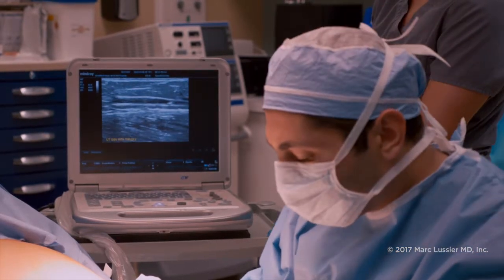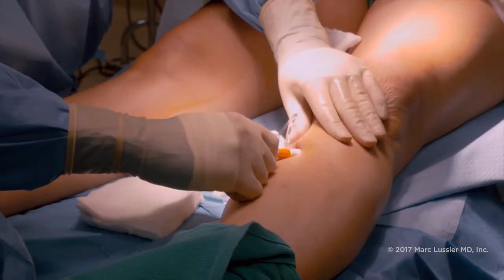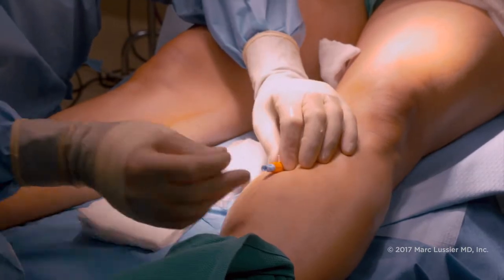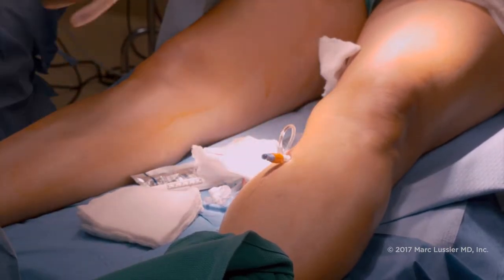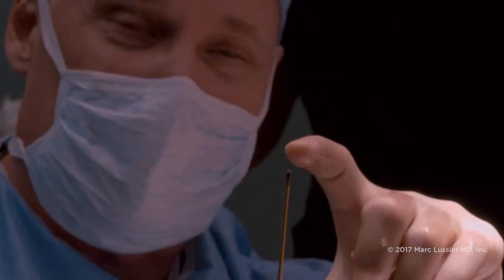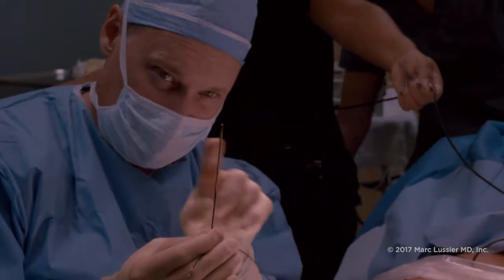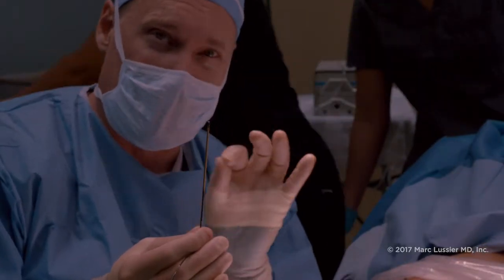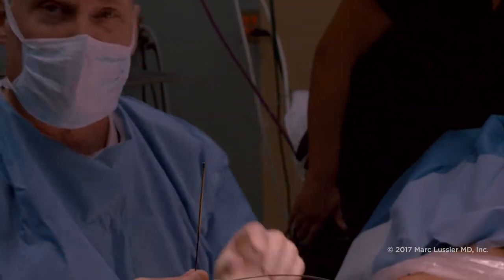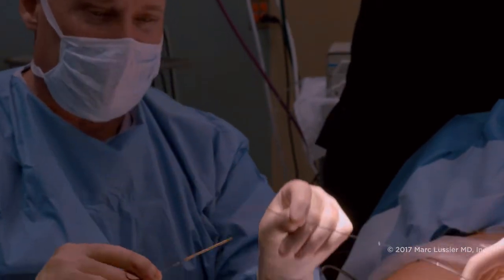I've gone through and I'm in the vein now. What we're introducing is a really clever device — the latest technology in endovascular radiofrequency ablation. What you see at the end is a gold tip on the end of a catheter, which we're about to introduce into the vein. This gold area is a device that generates heat, which will cause the vein to collapse.